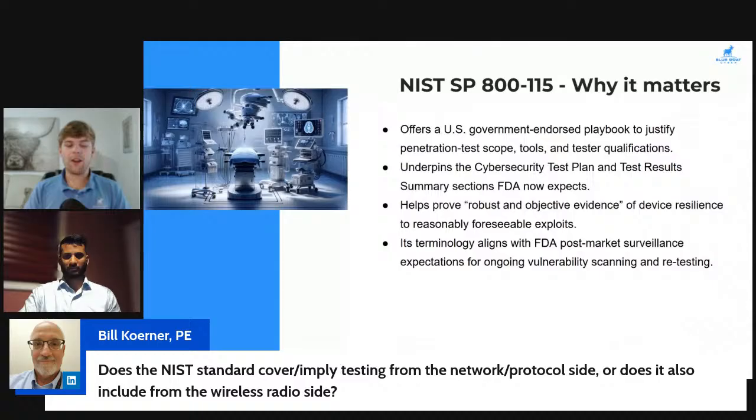All right. Now, I know that outside of just the penetration testing artifacts, Jordan, there's a lot that goes from the penetration testing into some of the other documentation. And so it goes back to that point that we keep making, that everything blends together in one way or another. But how do you think the outcome of penetration testing affects the rest of the overall cybersecurity submission materials?